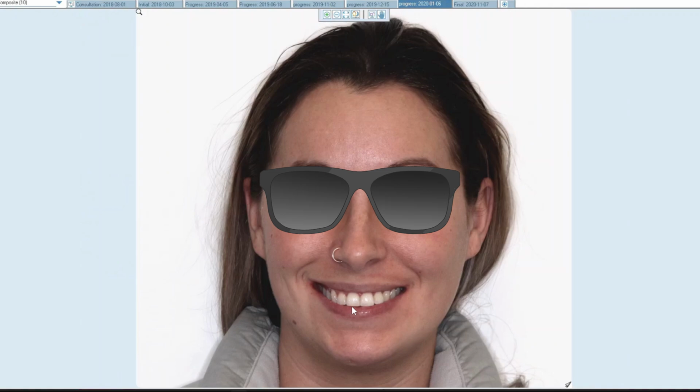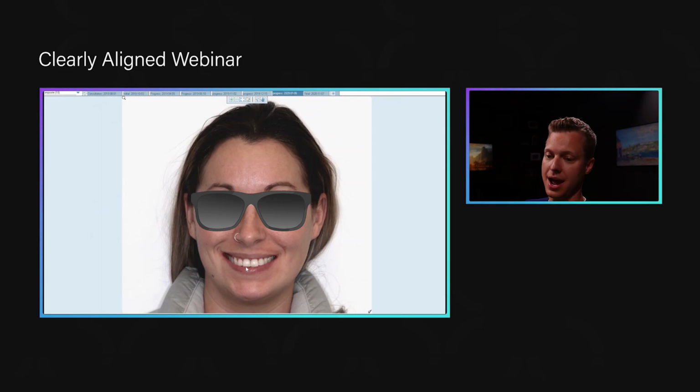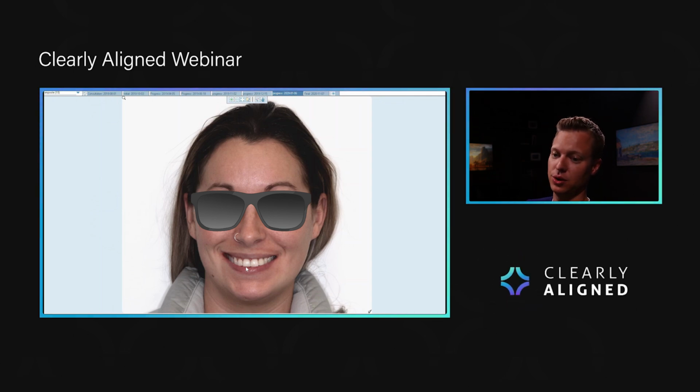And then at this point right here is where she's made the decision. And I normally just let the patient make the call on this. I asked her, are you happy? Do you want this to keep going any further, or are you good? And she says, no, I'm really happy. So we go ahead, we take out the TADs, and we're done.